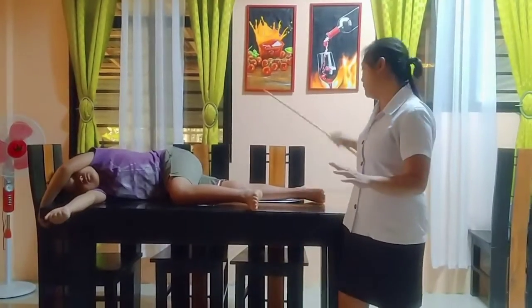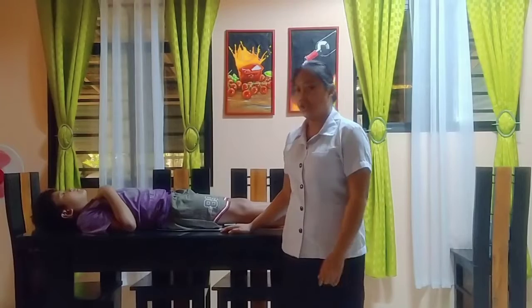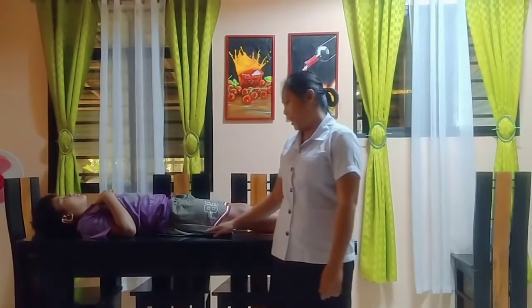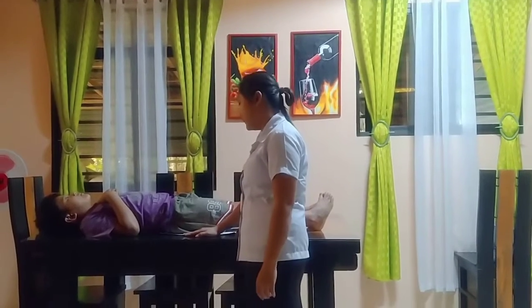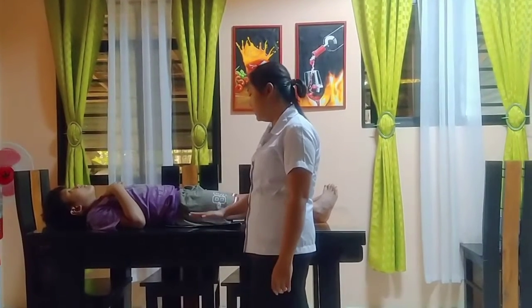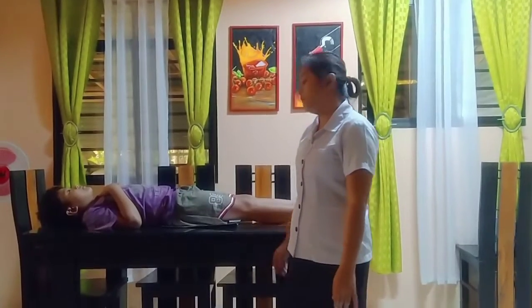Now, next projection will be the femur anterior-posterior projection. Instruct the patient to be in supine position. Now, ang IR po natin ay nasa ilalim ng ating pasyente. Now, let's see.